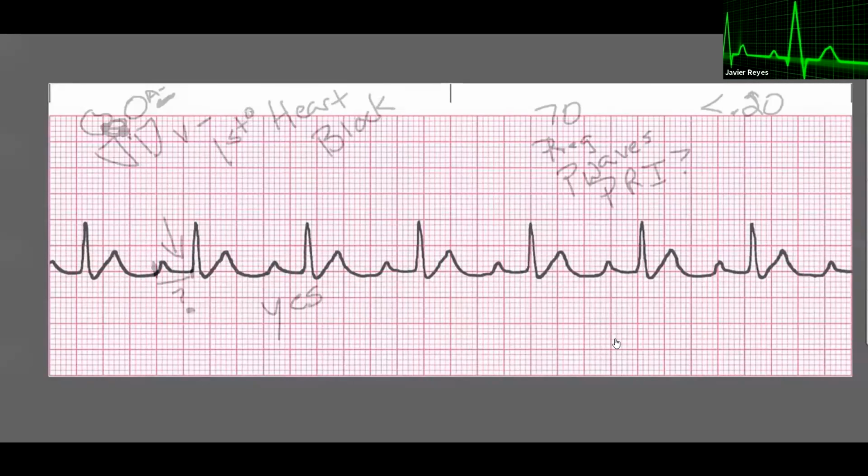First degree heart block. And this is the only one. This seems to be the biggest problem I have with students. Remember, this is the only one that you give a first name. So who's still in charge of the rhythm?